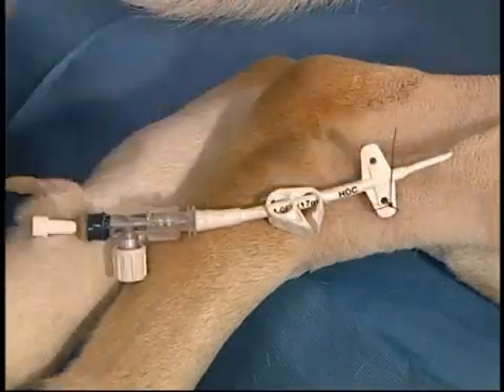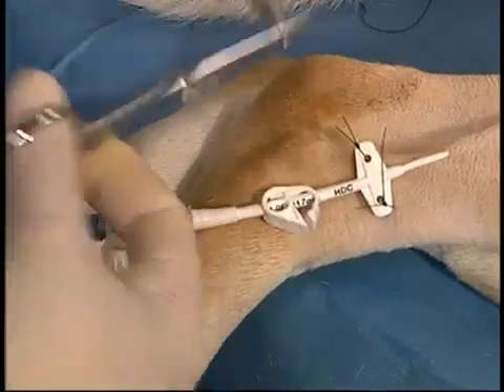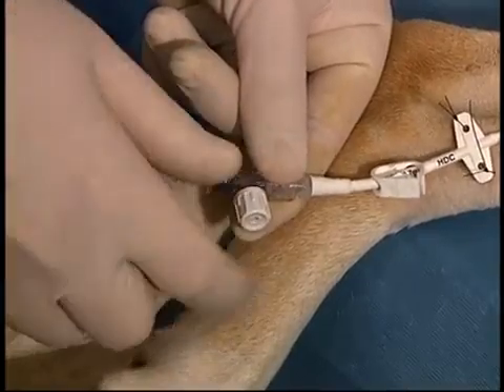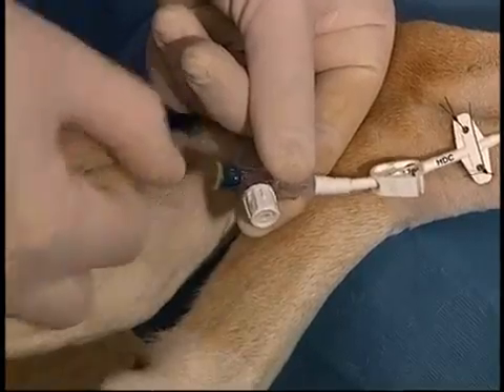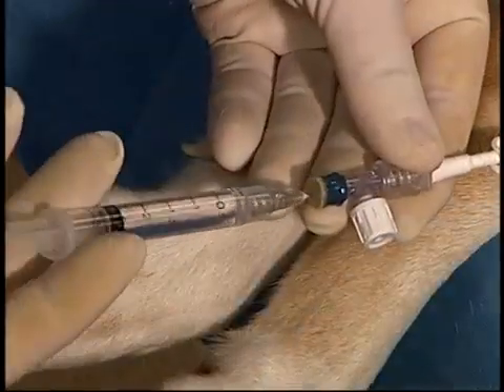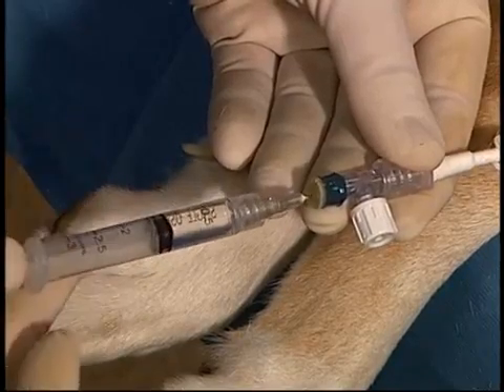Once the suture has been placed, the stylet is removed. If there is difficulty in removing this wire, the white cap is taken off and saline is flushed into the catheter while removing the wire. The catheter is then flushed and aspirated to see if blood can be aspirated back. If not, the catheter may need to be repositioned.